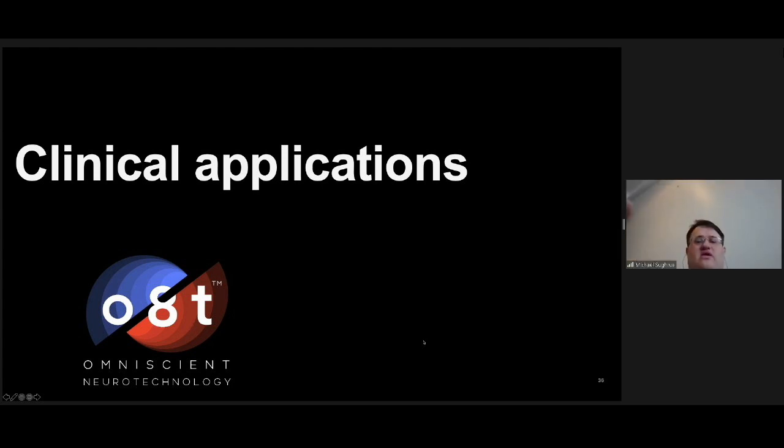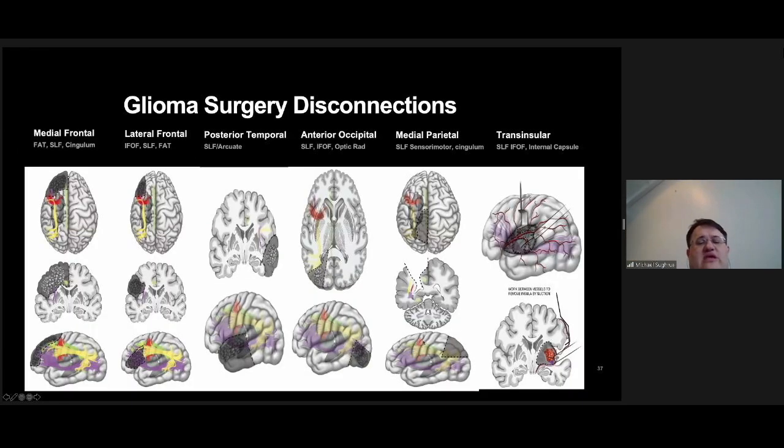So again, we aim to make the software able to do a lot of things, but one of the things that we wanted to bring back into connectivity-based research is the ability for clinicians to be part of the equation without having coding experience or professional programmers on their staff, et cetera. And so there's a lot of potential applications.